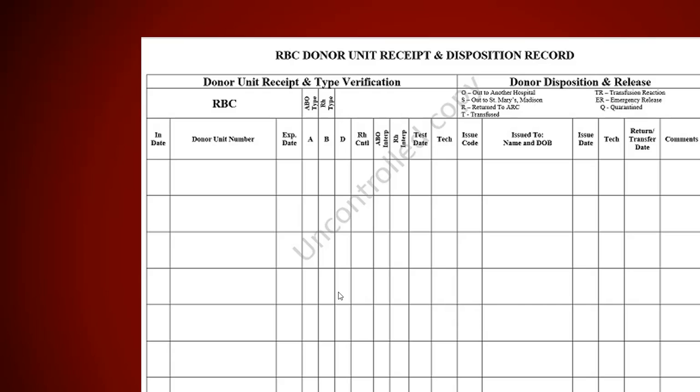So this is when you go through what your hospital has in inventory. Depending on, obviously, the hospital, everybody keeps kind of a different amount. We're about a 50-bed hospital, so we're not going to keep a lot around. So if, for example, we needed to order a couple dozen more units because this person has gone through so many, this is the sheet that we would use in such an emergency situation.